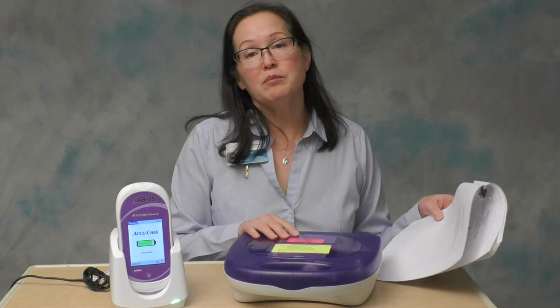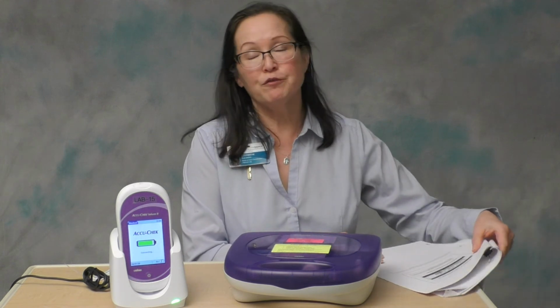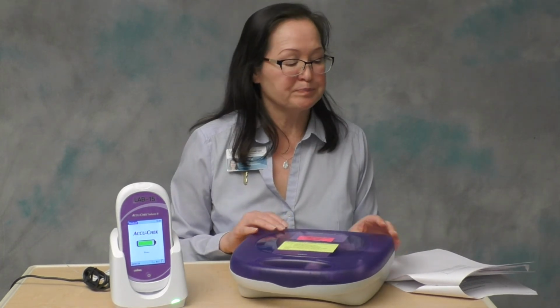And then you also need to make sure that you wipe the first drop of blood away after you have lanced the patient. That first drop of blood will contain a higher proportion of tissue fluid, so you could get an inaccurately low test result.